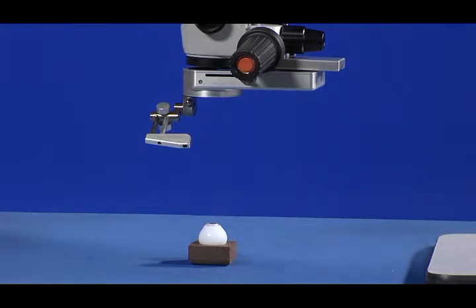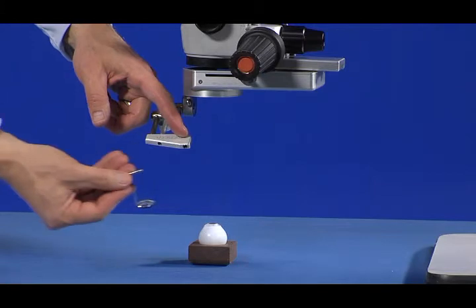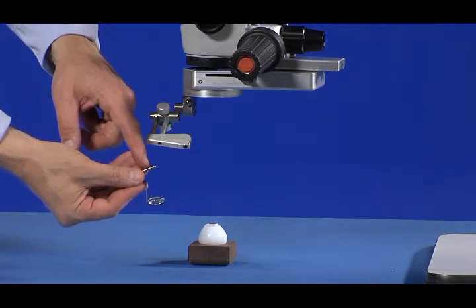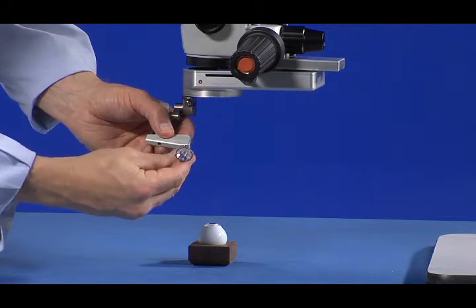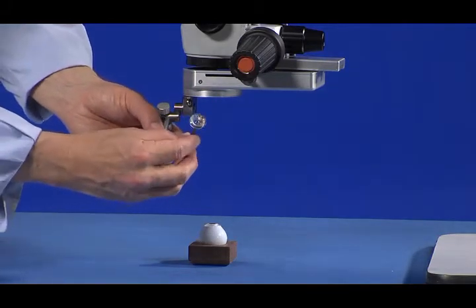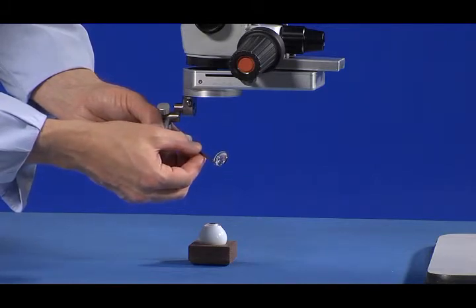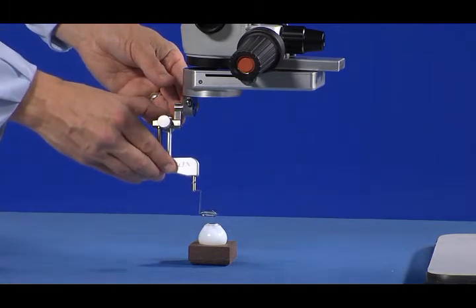The lenses are easily installed and removed. Simply insert the lens post into the hole at the bottom of the LPU and gently press in until you feel a click. The lens can be inserted in any orientation. Once inserted, gently rotate the lens until you feel another click. At that point, the lens is properly oriented in the LPU and will be centered in the optical path.